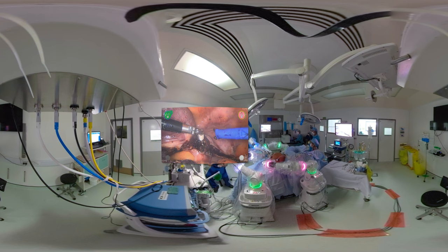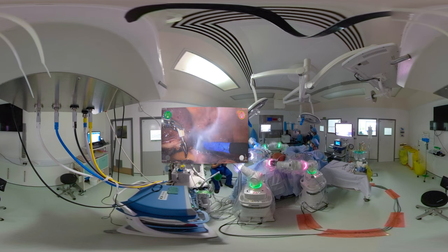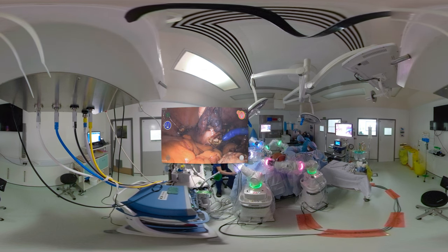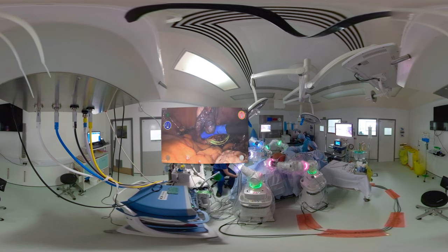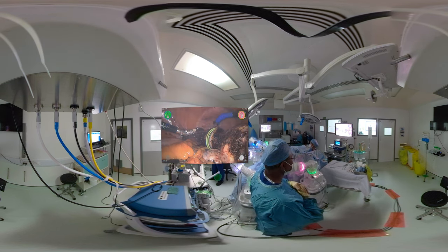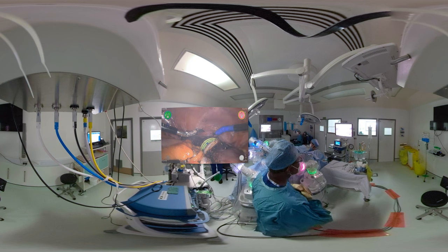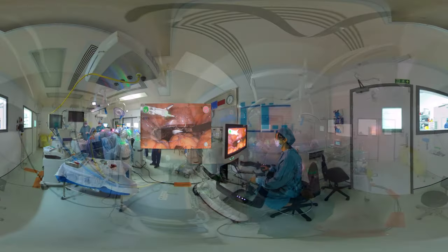We are going to coagulate some more vessels here — this is the ascending cervical on the right hand side. You can just barely see that green rim come into view on the right hand side, and then we're going to go around in a circle and complete the colpotomy. The colpotomy — we are now approaching the patient's left hand side. This is the utero-sacral around the left hand side. We're just going to go around in a circle, join the dots — just a little bit of tissue left there on the front. That's the colpotomy completed.